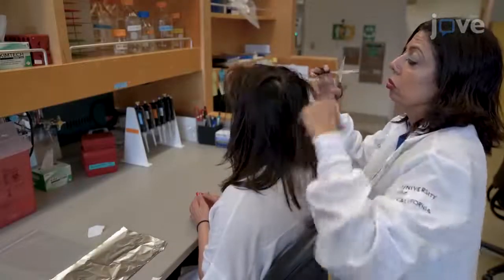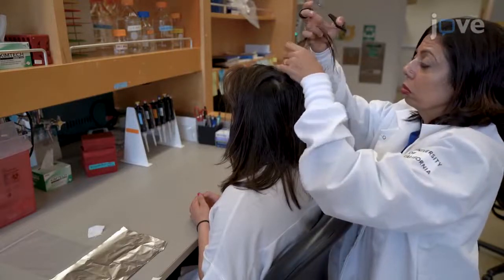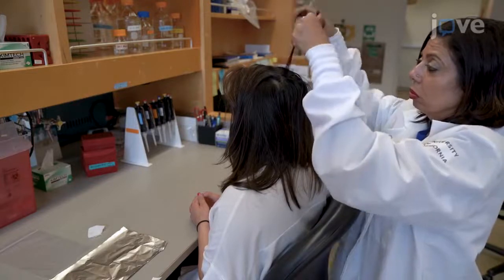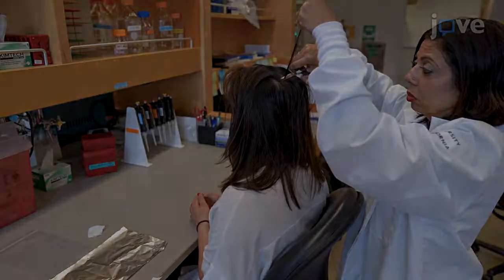Go to the back of the head and lift the top part of the hair using a hair clip if desired. Gather 30 strands of hair from the back of the head and isolate the thatch with your hand. Take the scissors down to the scalp and cut the thatch of hair.